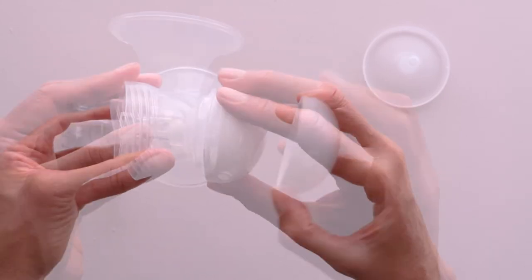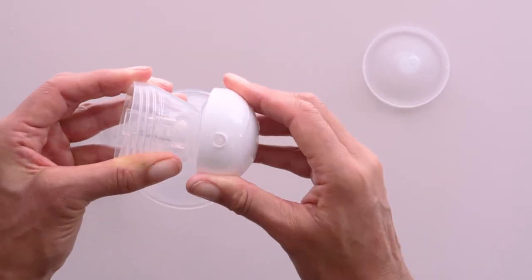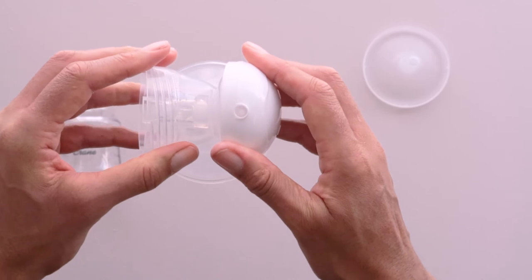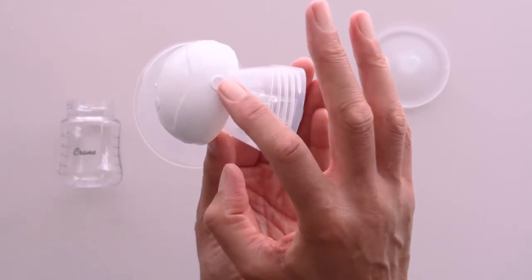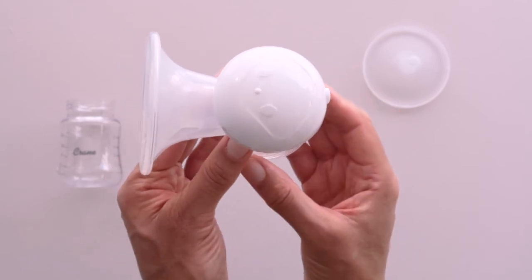Screw the cap on tightly to prevent any air from leaking. Ensure the tubing outlet is at the back of the body.